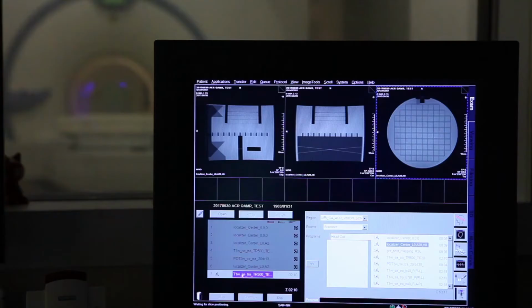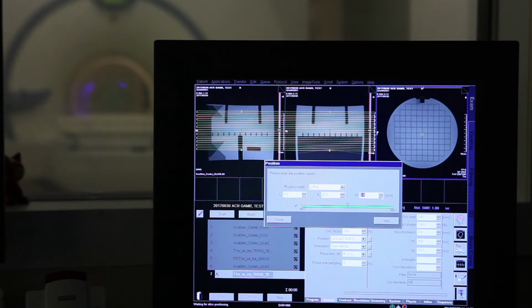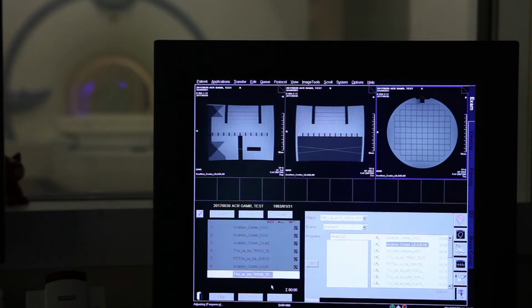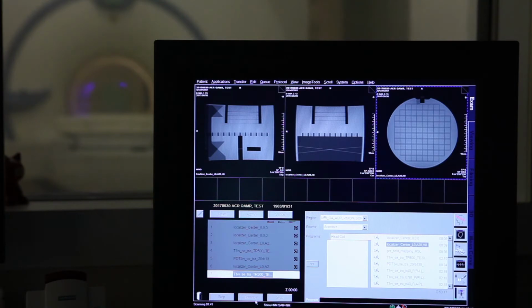So after having set the slices, you have to shift the slices to a specific position. You have to follow the markers of the phantom now. Okay? So we shift it digitally. That's the best thing to do. We have to shift it in the head-feet direction. So we go here, we shift the slice. See the slice moving. It's okay here. This first slice has to pass through this block, cross a line here and cross the ramps here. This is the marker that you have already positioned the slices on the phantom, and you are expecting to have specific images. At the end, you're going to take 11 images. You know from the beginning that you want to see specific images. If they're not like they should be, there is something wrong with the lasers. So with this test, we are also checking the positioning lasers. Right? Then we start. This will take 2 minutes, not that long, right? And then we work with this.